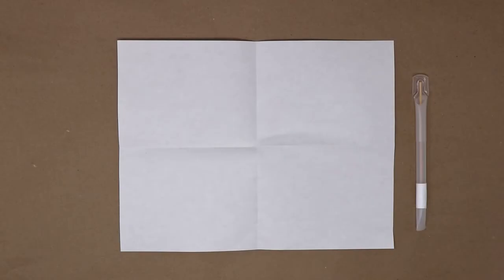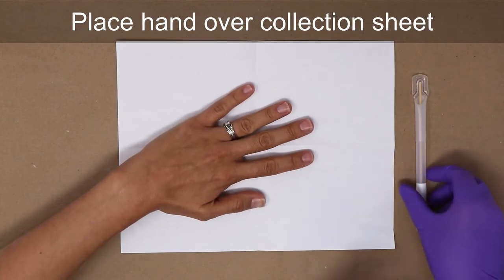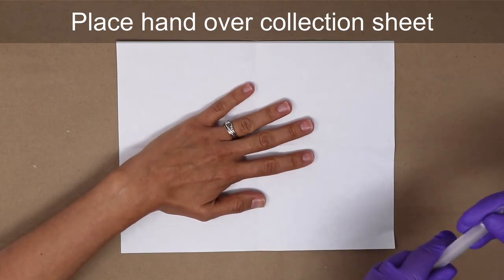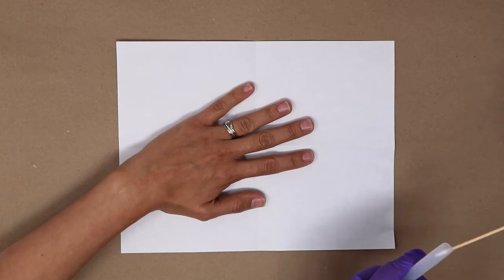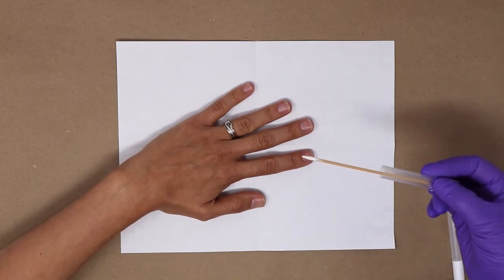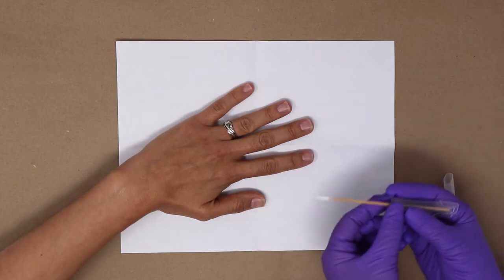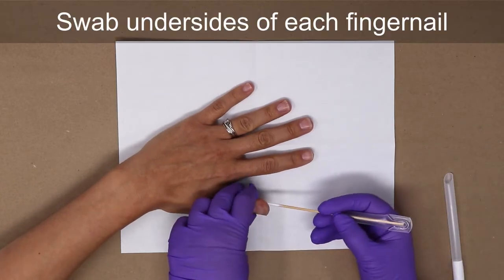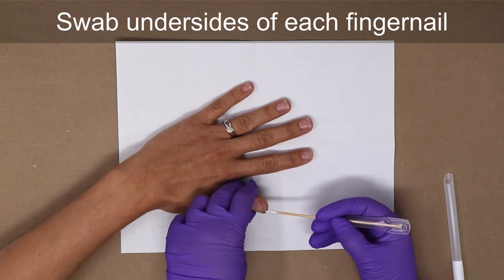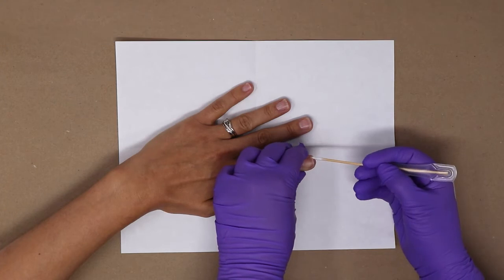The hand is placed over the collection sheet that's provided with Step 3. And a mini swab is used, moistened with sterile water, to sample from the underside of the fingernails. The fingernails are swabbed separately for each hand, 3-1 for the left hand and 3-2 for the right hand. And the swab is taken from the undersides of each fingernail.